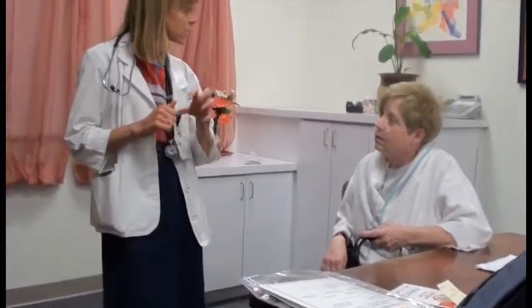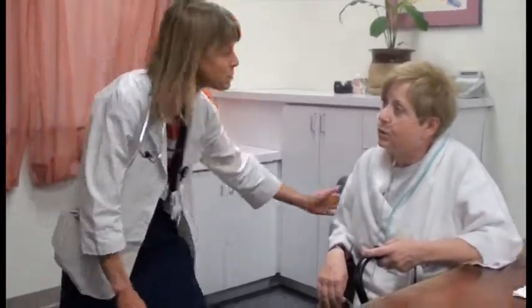You know what you could do is put a cup over the dials and just kind of hold it in place, tape it around there. Really? Like one of those styrofoam cups. That way she can't touch the dials. It'll be a barrier for her, because that would be dangerous if she's changing your dials. You won't be able to breathe too well. Well, she won't be here every day. It still might be a good idea for you, because you shouldn't be changing the dials yourself anyway. Yeah, whatever the doctor ordered, you have to stick with that.